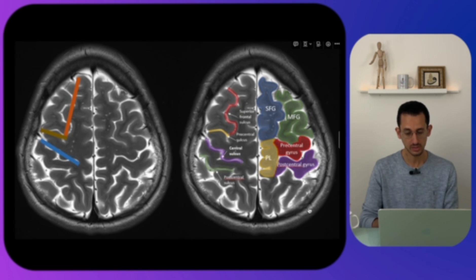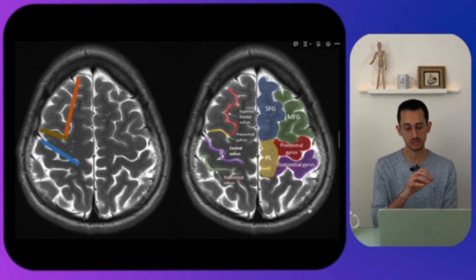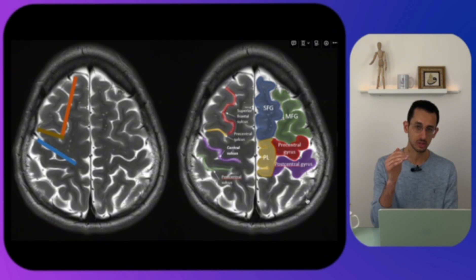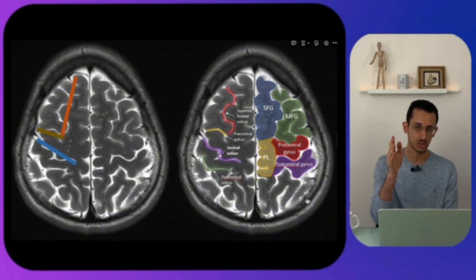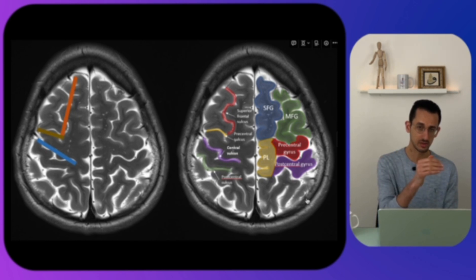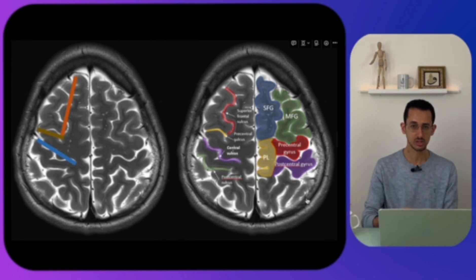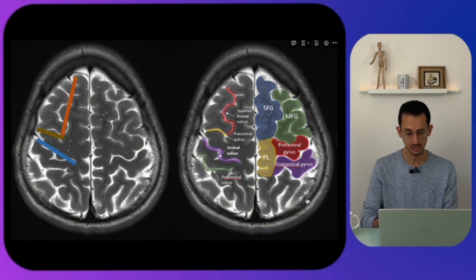So this is the first method — easy to understand and easy to use. Just go higher up in the MRI scan, find the L shape, rely on the superior frontal sulcus, then go backward. The horizontal part of the L shape is the pre-central sulcus, and behind that will be the central sulcus.